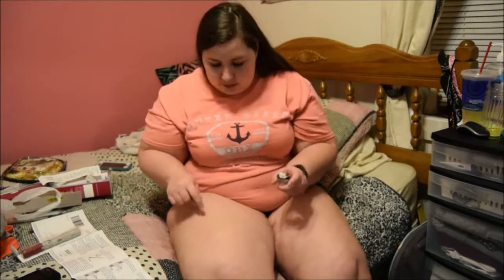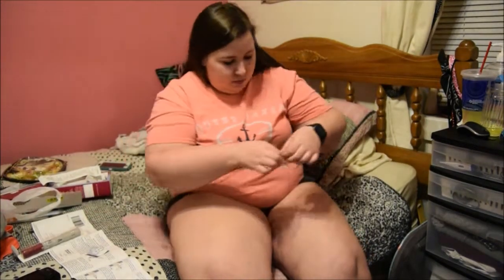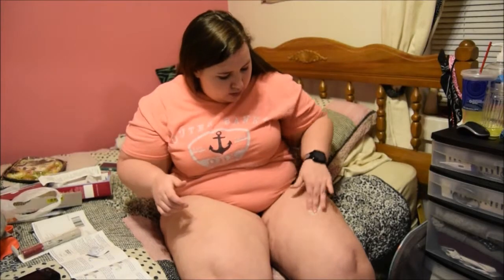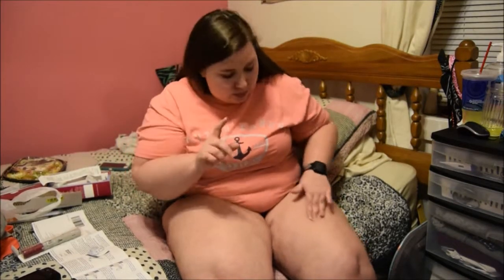But we're going to go now for round 2. Now round 2, I know what I'm doing a little bit better. On the opposite leg, I just did it on this leg. So I'm going to go ahead and do it on this one. So let's swab this. Make sure we get a good alcohol prep on here. And I don't know if you guys saw me because I was talking to my stepdad who was reminding me of how to do these.